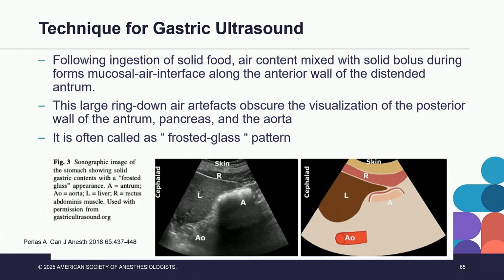And this is the frosted glass pattern. I remember I was doing a workshop, and the model had just eaten, so I put the ultrasound on and found that, and I told them, guys, I'm sorry, we cannot proceed.